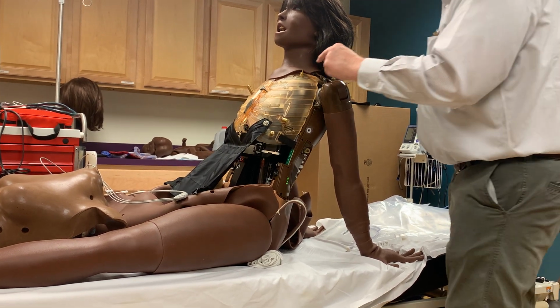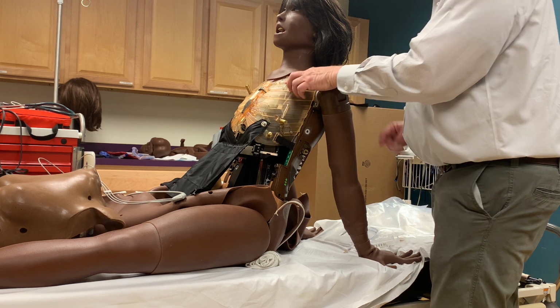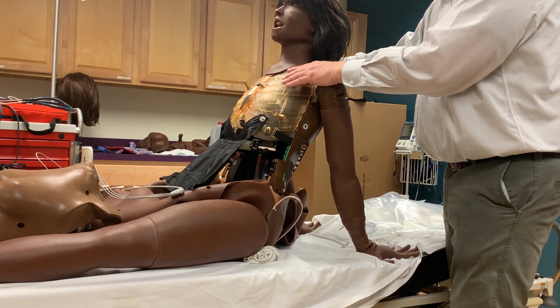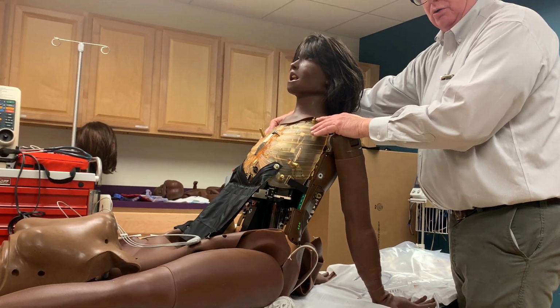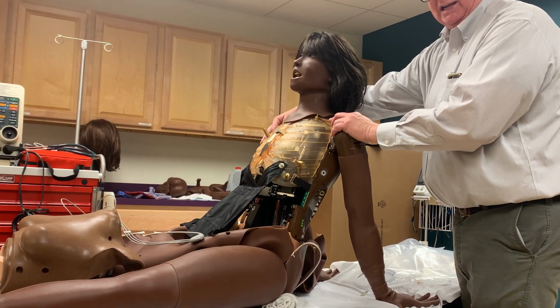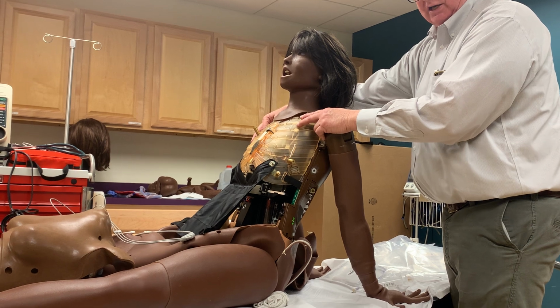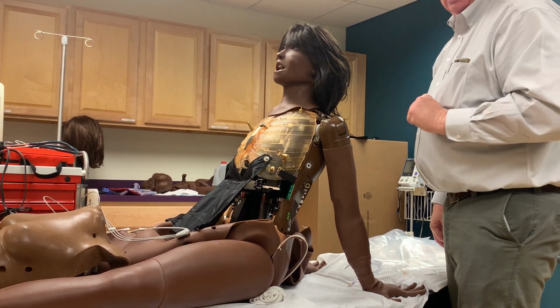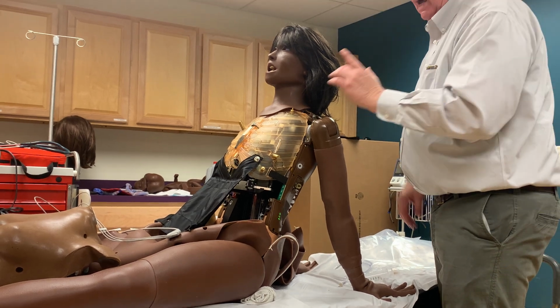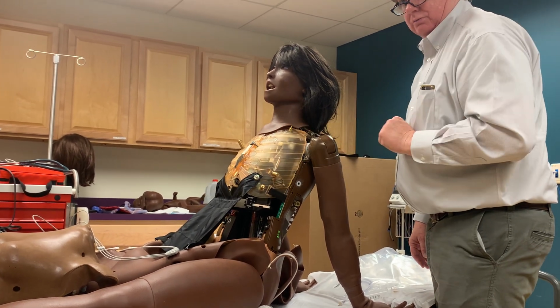Right, let's say they were correctly over the speaker here and they're really hearing transmitted sound, and they miss the speaker over here completely. They may think, oh, she's not breathing on the right side, when in fact it's on the left-hand side. This is why the location is important in her, because everything's tied to, do they have the stethoscope in the correct location?